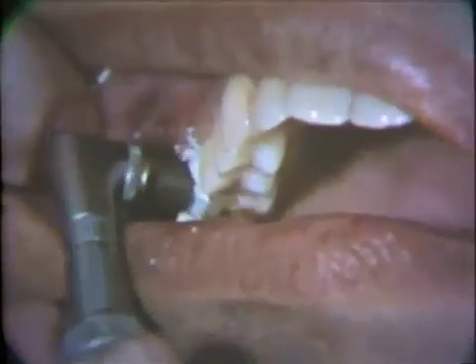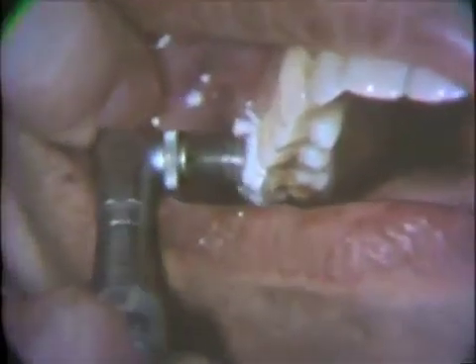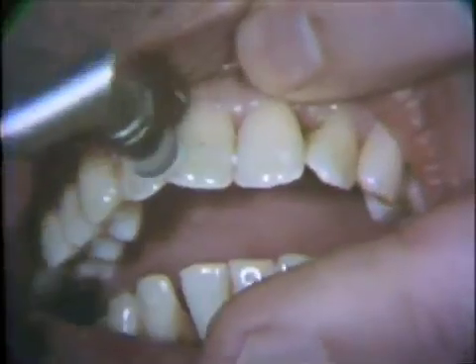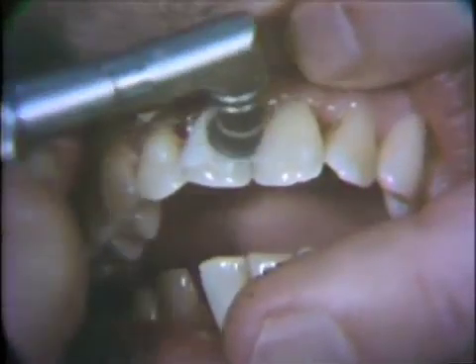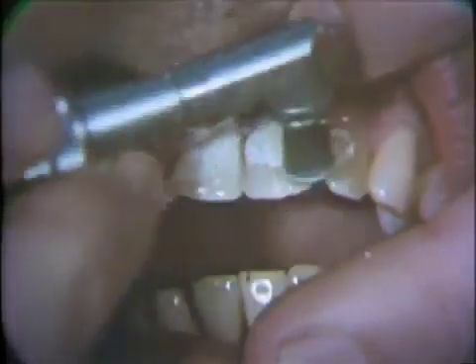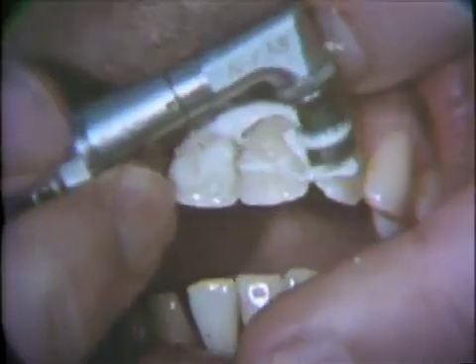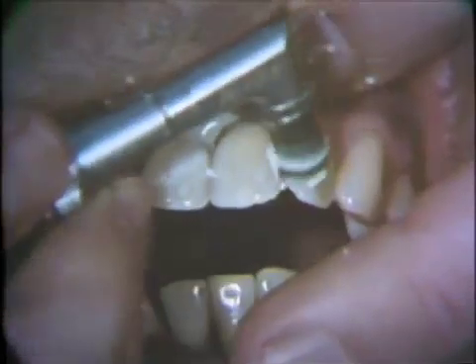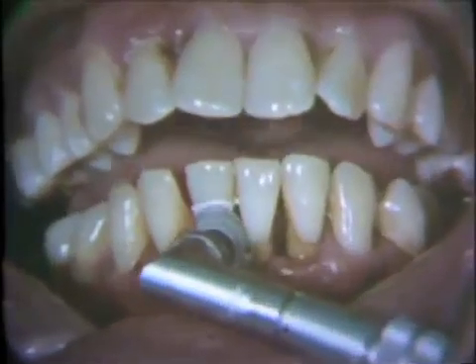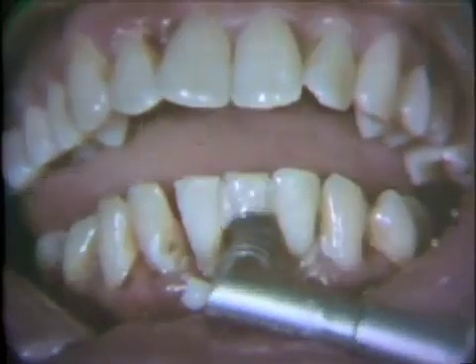A contra-angle holds the rubber cup, which is filled with polishing paste. This is used on all the teeth. The thin borders of the rubber cup make it possible to polish slightly under the free gingival margin of the teeth, as demonstrated here in the anterior region. Although the rubber cup is extended interproximally as much as possible, it does not provide adequate interproximal polishing. This is especially true in the mandibular incisor region.